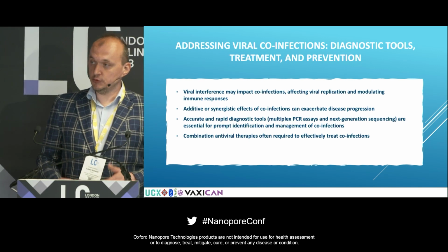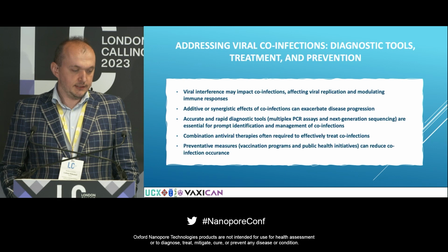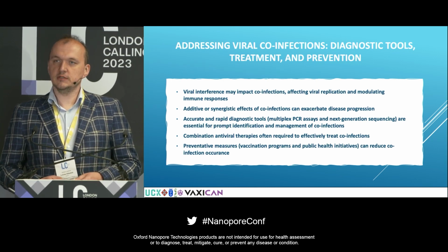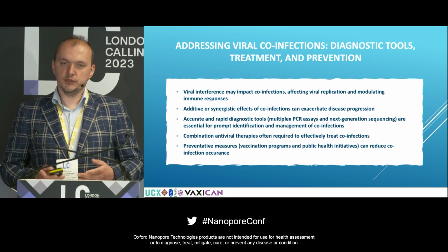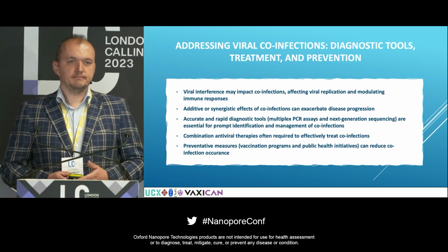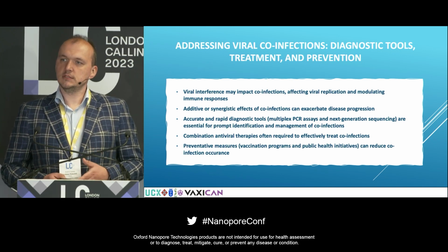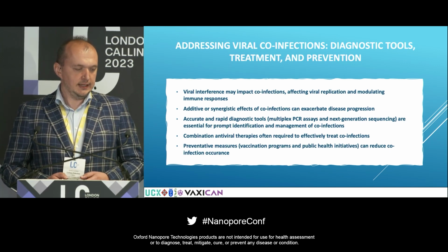The biggest problem is that co-infections can increase the severity of the disease, and it can be problematic to treat because of the diagnostics. The groups especially involved are small children, 5 years or younger, the elderly, and people during or after chemotherapy. For now, diagnostics are based on multiplex PCR, which is often a proprietary closed system, or in-house developed multiplex PCRs.